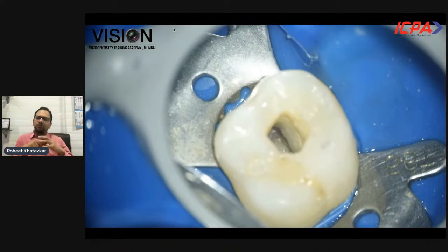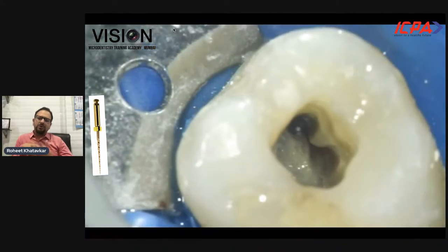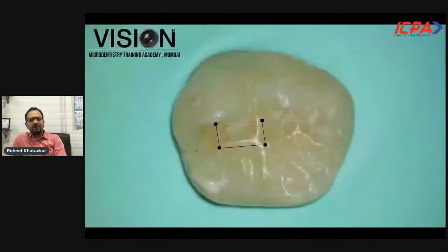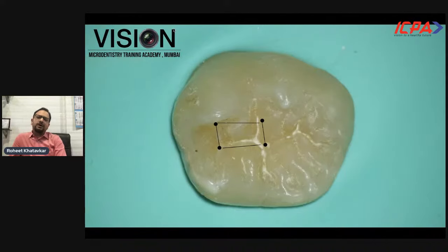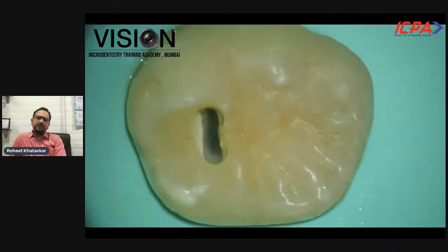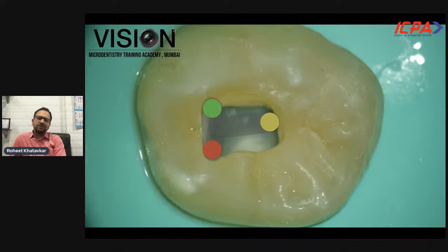It is important to have good visualization and remove any restrictive dentine for better visibility to the canal orifices. Here you can see the MB1 and MB2 canal orifices after only coronal preparation and removal of coronal interferences — we have not yet done any cleaning or shaping of the tooth. The same approach applies to mandibular molars — from the radiograph we determine whether to expect three canals (two mesial, one distal) or four canals (two mesial, two distal), and map the access cavity accordingly to locate mesial canals first, then extend to locate distal canals with least collateral damage.